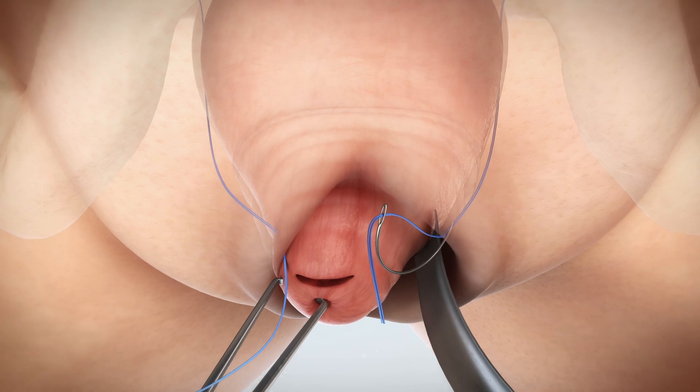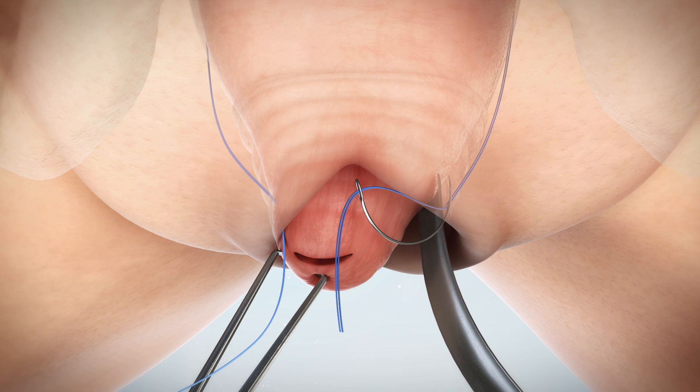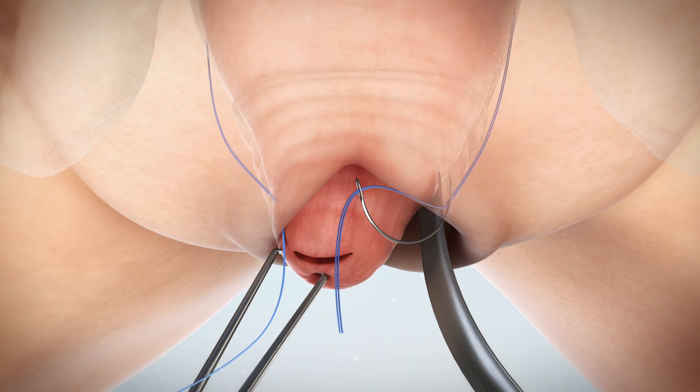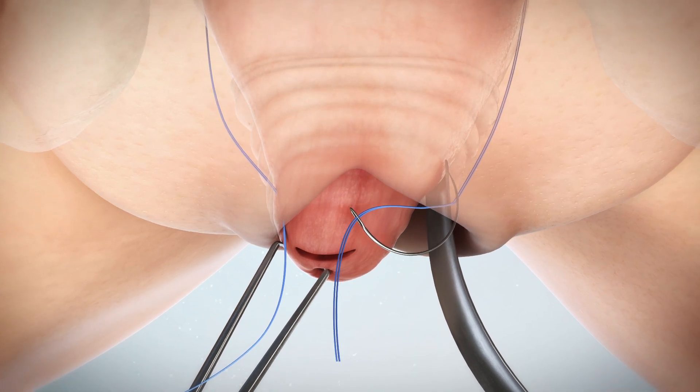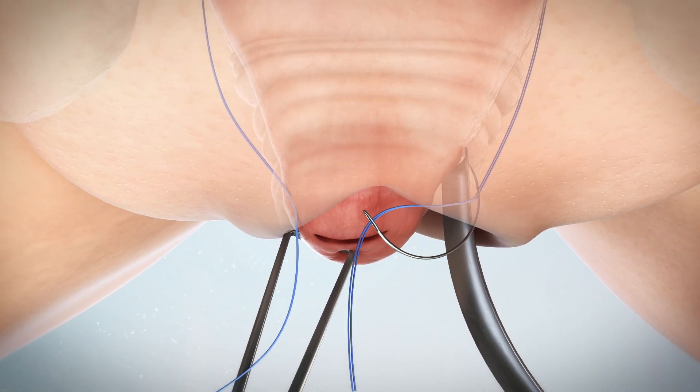Using a needle driver, guide the free needle through that puncture and behind the vaginal wall, exiting the cervix incision. This step safely and completely removes the suture from the vagina. Point the needle tip toward the suture's exit point in the stroma. It may help to have an assistant use an alice clamp to manipulate the anatomy and help the free needle exit the stroma.